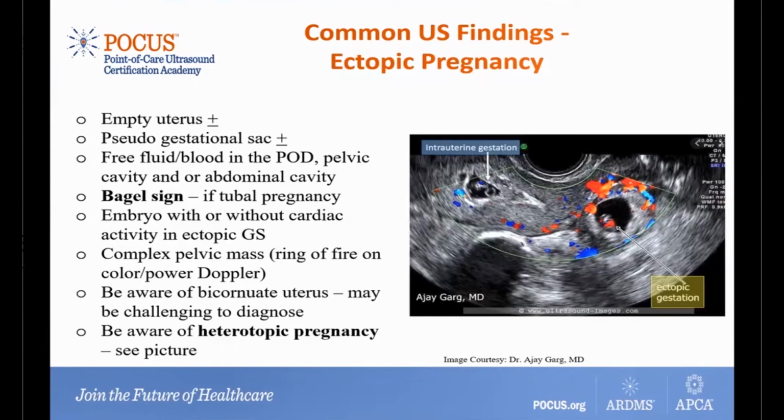And obviously this patient has not had a rupture yet, so you want to recognize it early on. Once it starts bleeding, it's pretty catastrophic bleeding. I've seen patients who bled 2 to 3 liters in the abdominal cavity and they came in shock. And then of course we'll see free fluid, and if you have a patient whose pregnancy tests positive and you see free fluid with no history of trauma or abdominal pain, what else could it be?